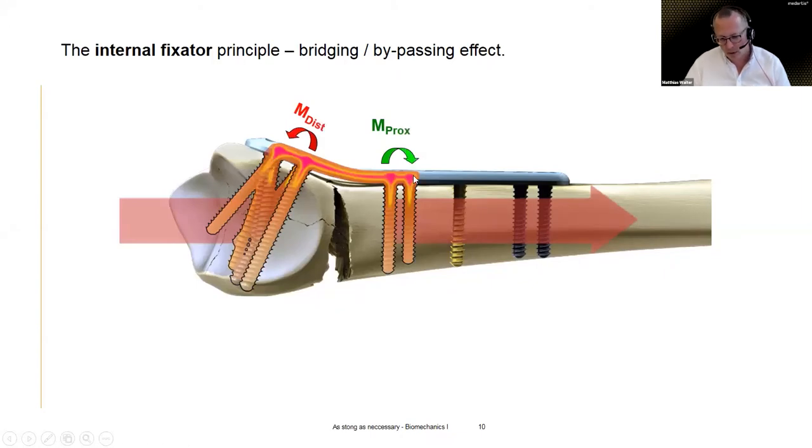This bending moment travels along the metalwork, and is fed back as a proximal bending moment into the radius shaft in this particular case. But once again, this could also be a tibia. This could be any kind of bone with a defect, it doesn't really matter.